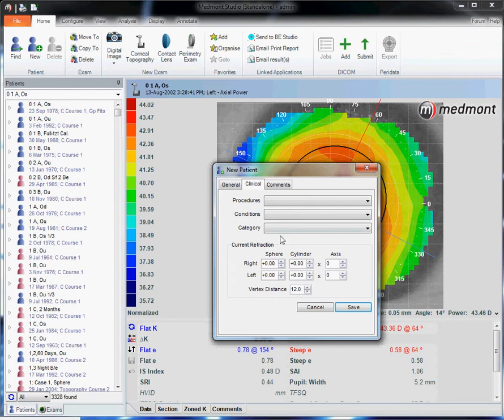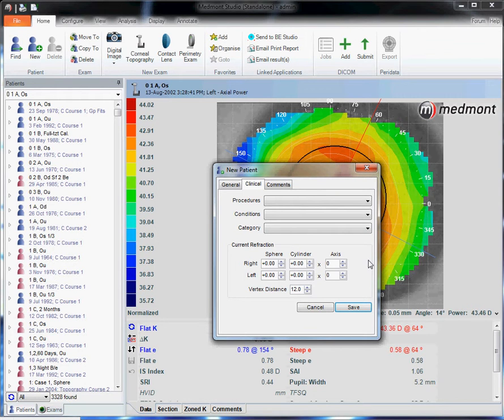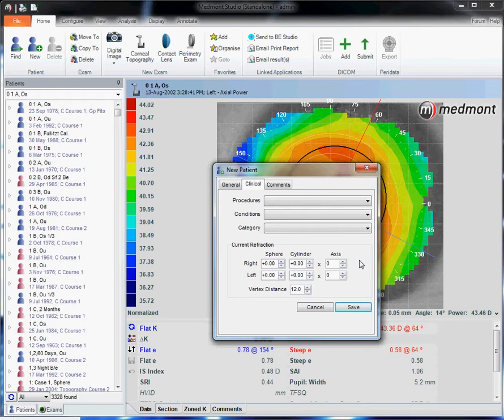At the bottom, you'll see an area for the Rx. Here you can enter in the patient's Rx and whenever you pull up a new contact lens, it will automatically populate in the contact lens software. That way you don't have to enter the Rx numerous times each time you create a new contact lens.